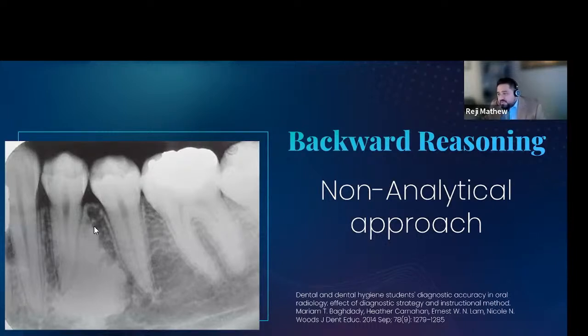In this case, you wanted to rule out if it's a periapical cementoosseous dysplasia, or if it is any other pathology, so that you can have those diagnoses. Now, my goal with all these slides was for any students who are in first year or second year, or probably third year, final year: describe your lesions.